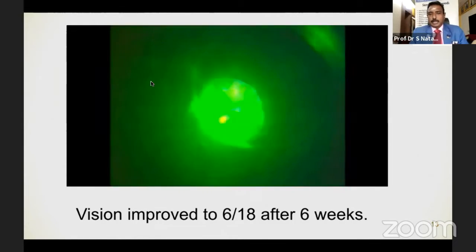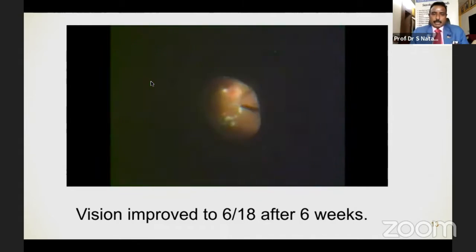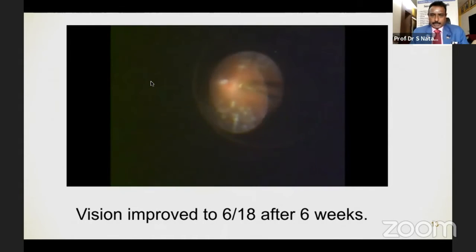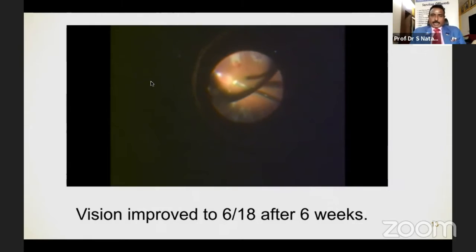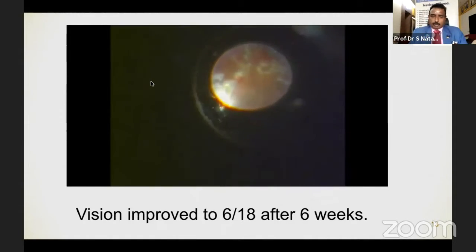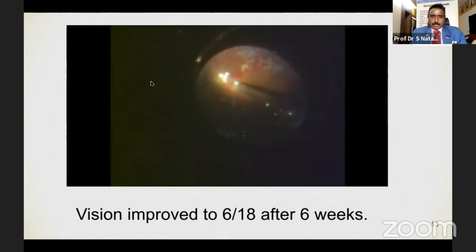And in this sort of eye where you cannot give anti-VEGF pre-op, we do the vitrectomy, and at the conclusion we give the anti-VEGF, and again at the end of 1 month if required, performing OCT and angiography. If needed, you enhance with further laser photocoagulation as well as anti-VEGF injection. So you can see fluid air exchange done, and that's the advantage of using the BIOM or any other wide angle system, where you can work under air. And the view is so good, particularly using the 3D.